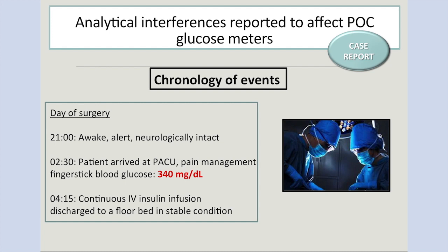At 2:30 in the morning, arrives at the post-anesthesia unit, looking for pain management. They did a finger stick. I had to smile because when I did this slide, I didn't put capillary on. I've changed the term now to finger stick. The finger stick was 340, definitely going to get your attention.